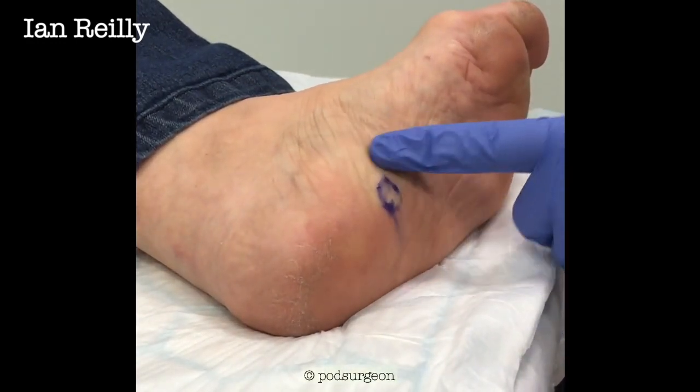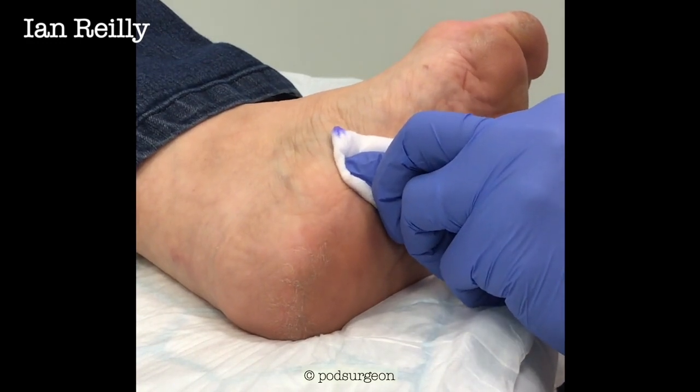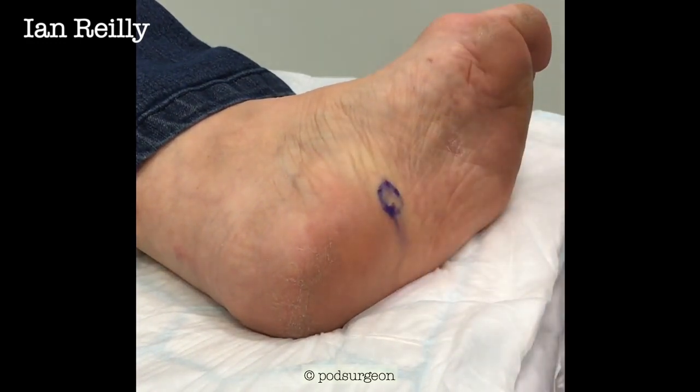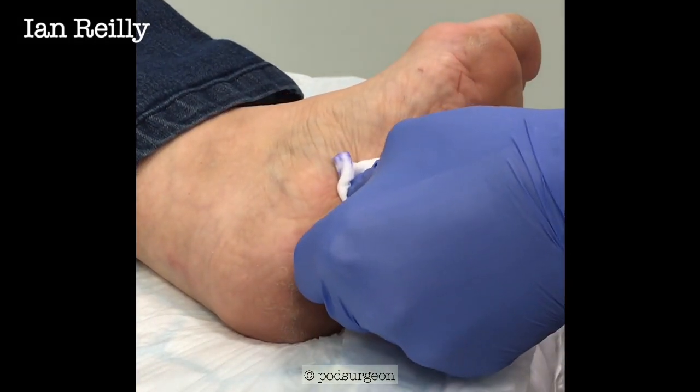So we'll put a little dressing on there. Really, very quick technique. But we're going to re-scan this lady, and the plan is actually to write her up as a case report and see the difference. So we're going to put a plaster on that now.